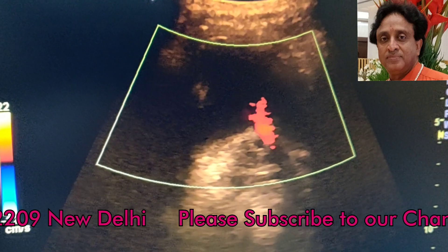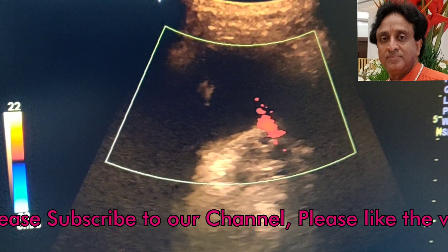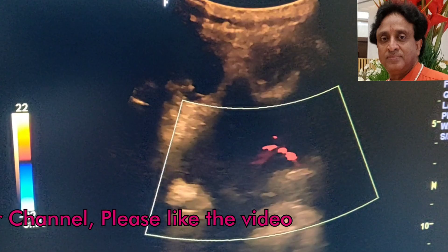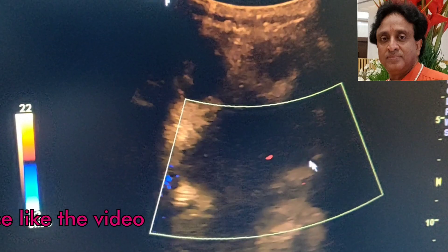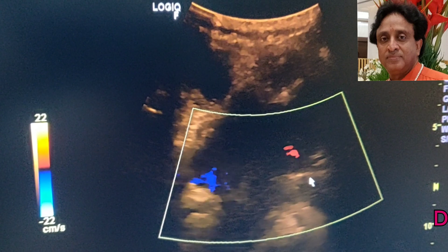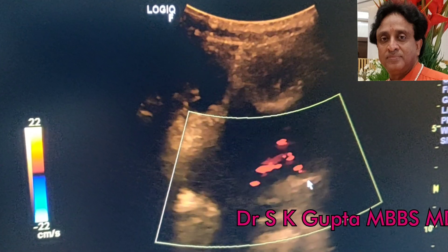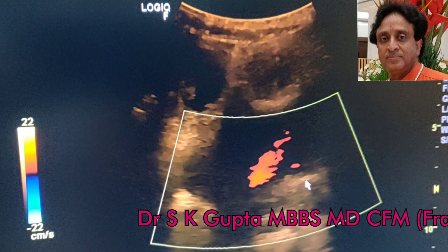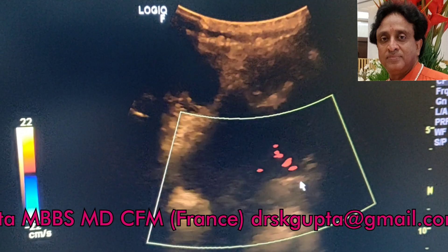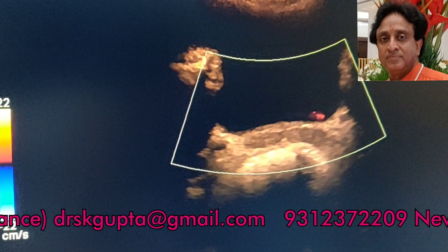Now looking at the ureteric jets into the bladder, we find there are two ureteric jets in the bladder and both jets appear to be crossing each other. This is the right-sided jet and this is the left-sided jet, so both kidneys appear to be functioning. If there is any extra ureteric jet on the left hand side we could not demonstrate it, and cystoscopy could be a better investigation to demonstrate the same. Both ureteric jets suggest that both kidneys are functional.